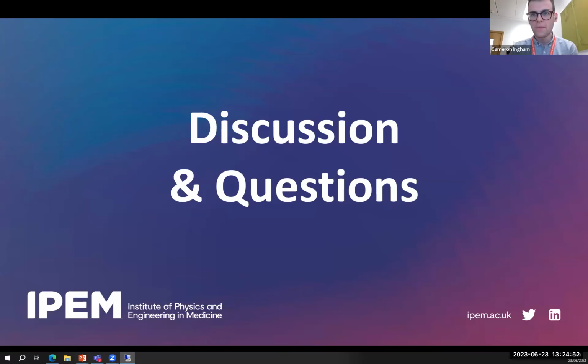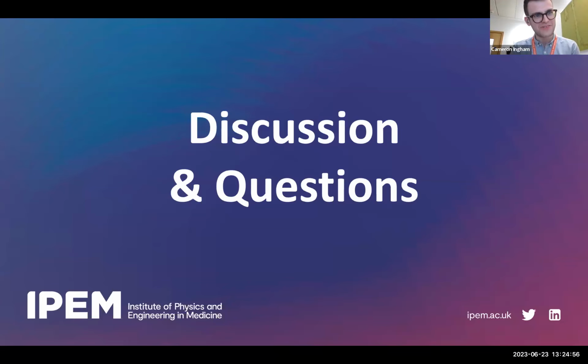Excellent. Maybe a question about how we might have collectively phrased certain parts of the presentation. Rose is asking whether Deep Resolve Boost is available with SE because of its compatibility with Grappa. I think so. Spin echoes don't. The base sequence for spin echoes doesn't allow you to use Grappa, but it does allow you to use Deep Resolve Boost. That's very well cleared up. I didn't know that.